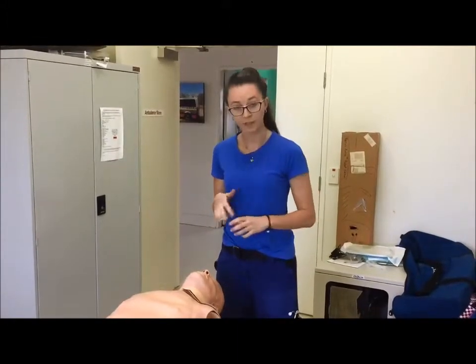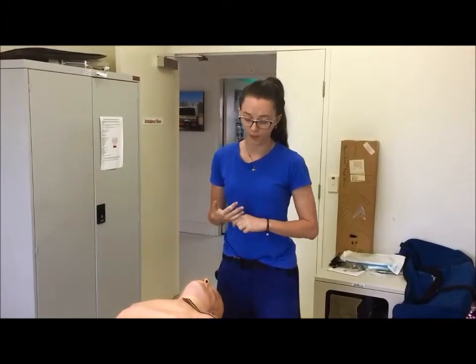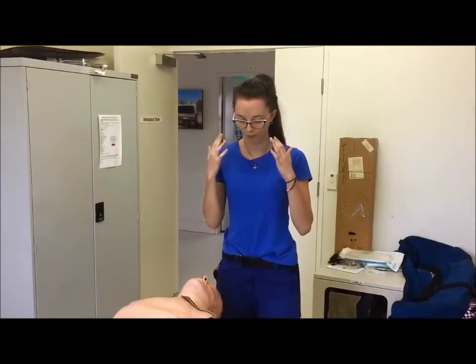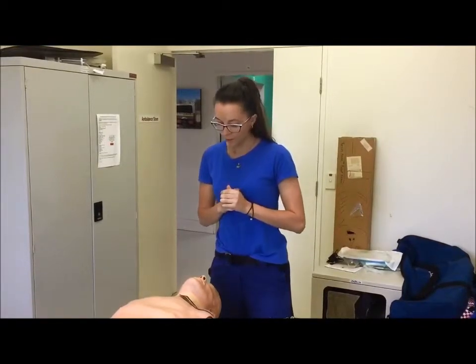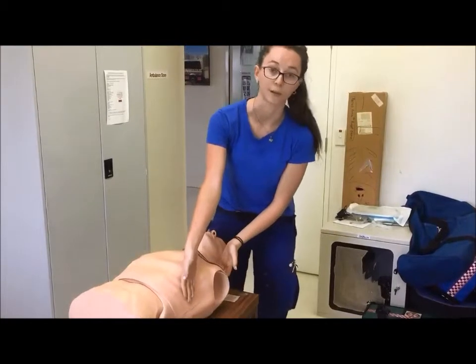The procedure for the finger thoracostomy is a number of steps that involve infection control and appropriate placement of the required items. So firstly, we would take appropriate infection control measures, such as donning gloves and goggles. Secondly, we want to abduct the arm greater than 90 degrees to expose the area that we want.